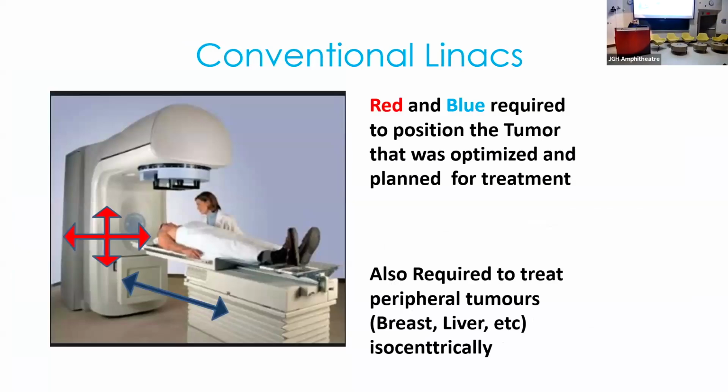Something else we wanted to look at is not changing the whole field, because you're inserting this MRI. Already we know that if you're not careful, you create problems. But would it create other problems if I put in an MRI? Let's go back and look at the conventional linacs that we've been using for 40 years. What you see on your left is a linac head, an old one, and it rotates around that couch. The patient lies on the couch, and the center of rotation is the isocenter. You'll notice I put dark arrows and red arrows. MR couches do the dark arrow motions, but the red ones they don't. So in an MRI, you cannot do that.